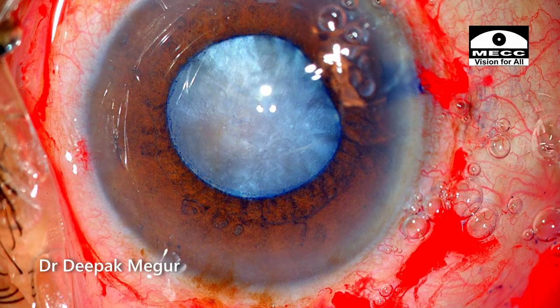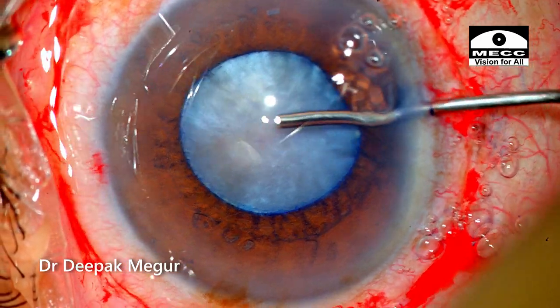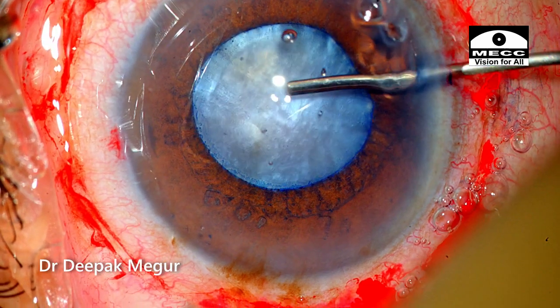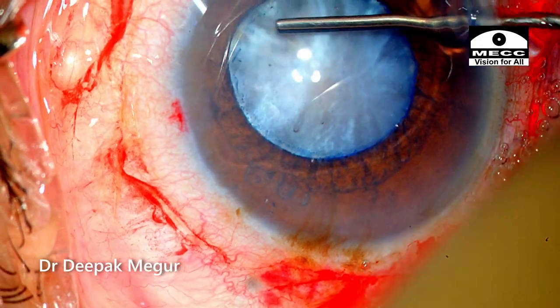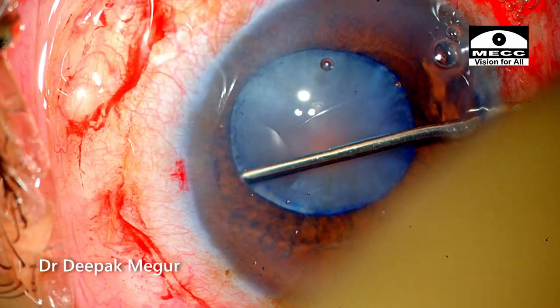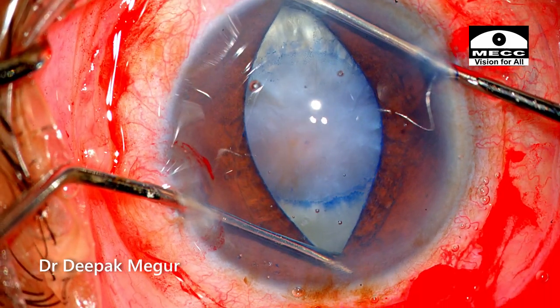My plan is to stretch the pupil and then take a call regarding whether I would like to use a pupil expansion device or not. OVD is injected under the iris to lift it up so that the Y-hook doesn't touch the anterior capsule during the stretching maneuvers.